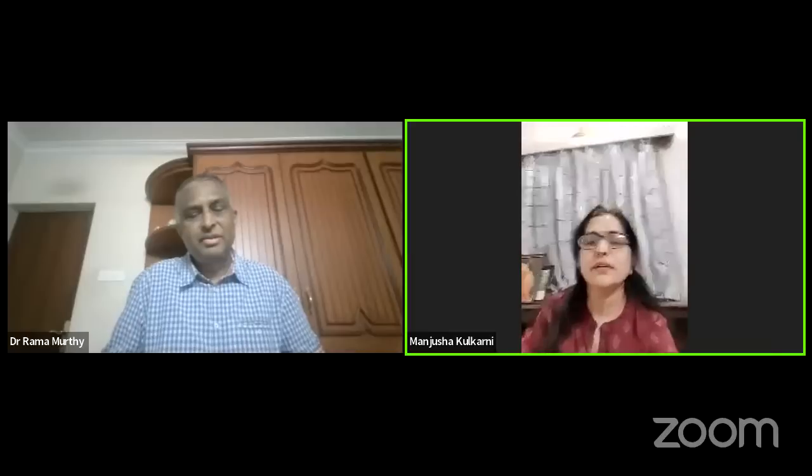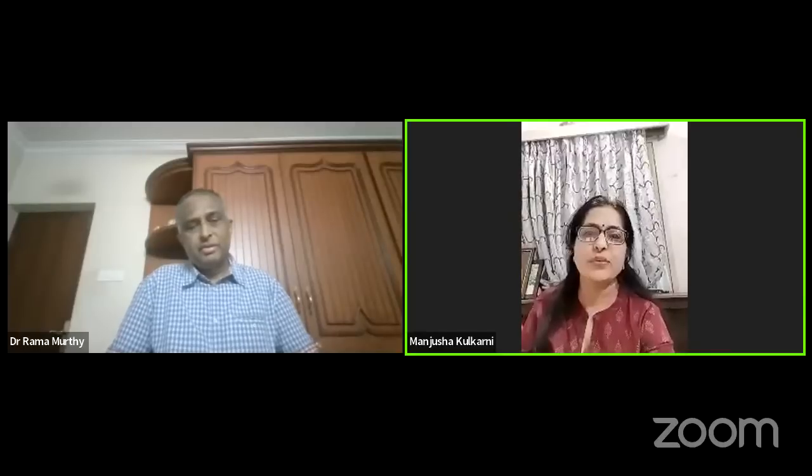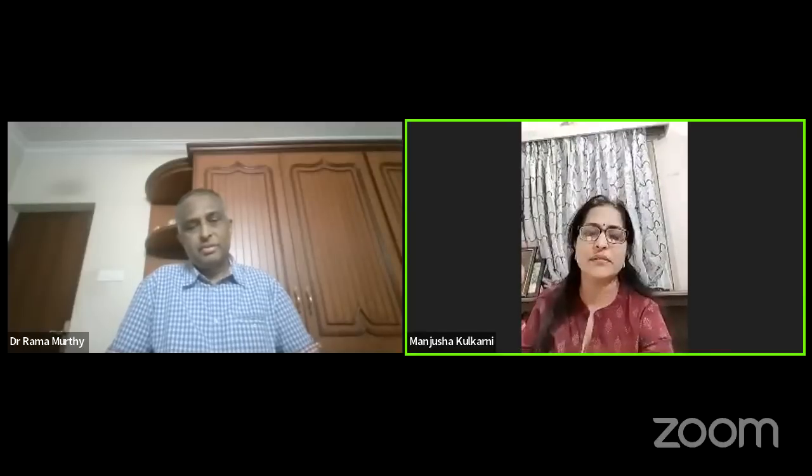Sir, can you please repeat? Sir, I want to ask a question. Yes, please. At times, it is difficult to differentiate a tetralogy of Fallot from a DORV. Is there any definite criteria? Sometimes it is confusing. So how do we go about it, sir? The overriding artery, the way it is committed more to the right ventricle or more to the left ventricle is important.